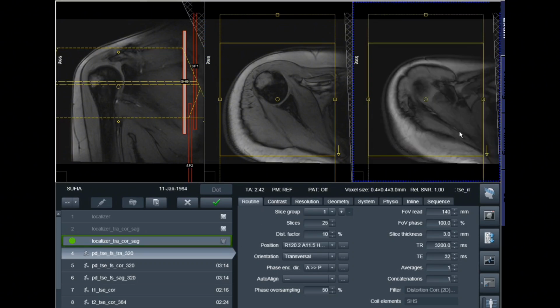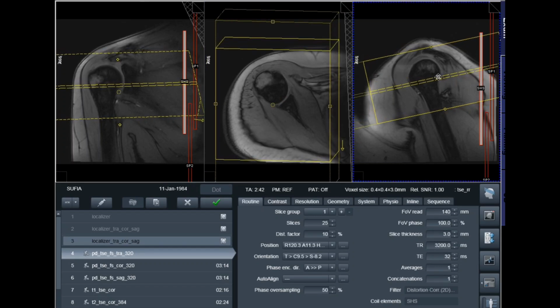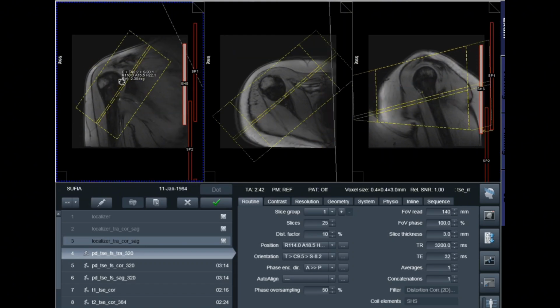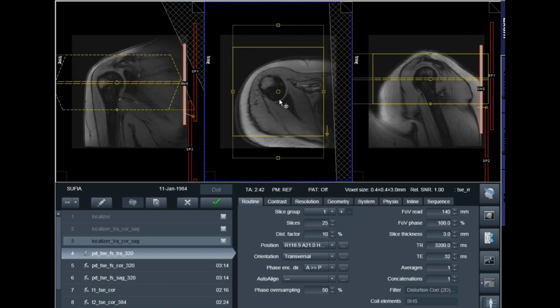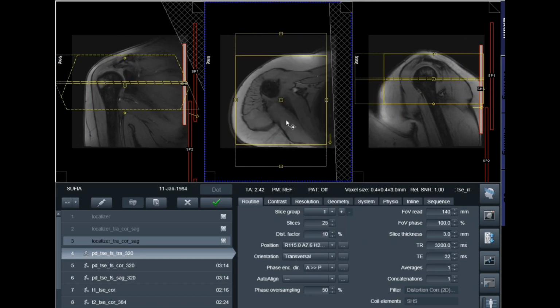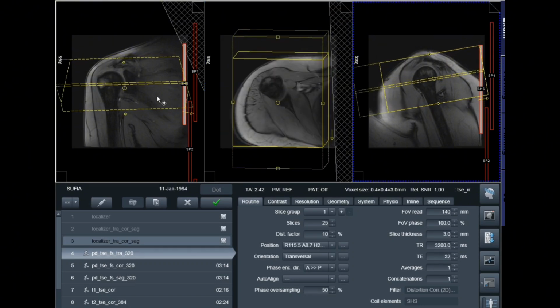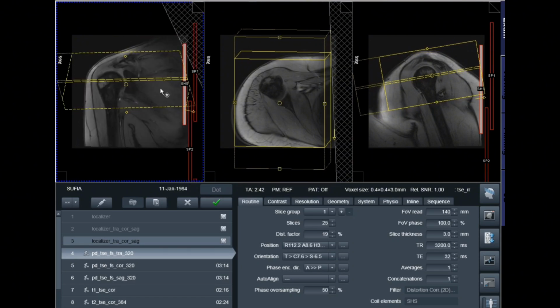The rotator cuff plays a vital role in dynamic stabilization of the shoulder joint. It consists of supraspinatus, infraspinatus, subscapularis, teres minor. Additional structures: glenoid labrum, increases joint congruity, joint capsule, coracohumeral and glenohumeral ligaments, subacromial subdeltoid bursa. MRI provides excellent visualization of all these soft tissue structures, which are poorly evaluated by X-ray or CT.